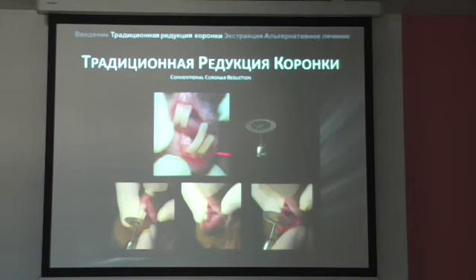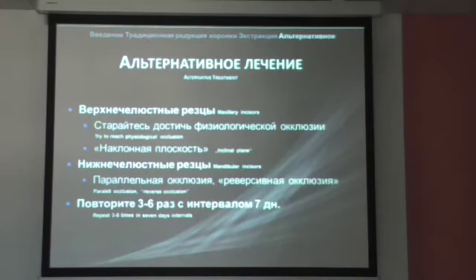We use them for the correction of the incisors. We don't adjust just the clinical crown height, but we even adjust the occlusal surface.